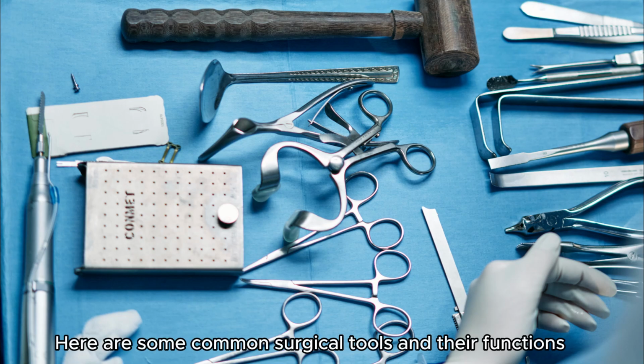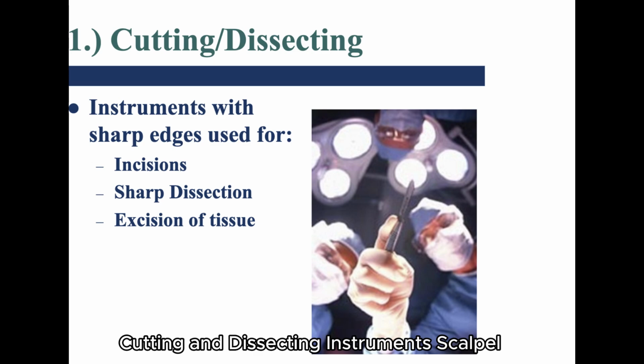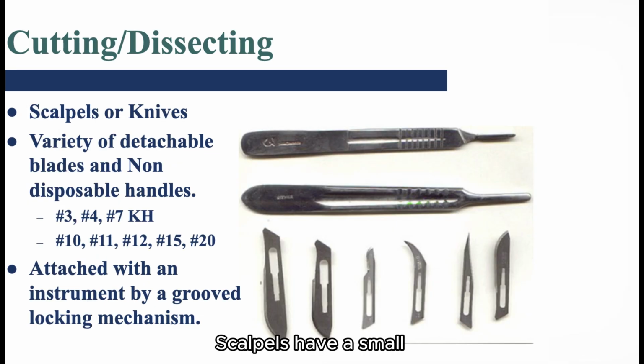Certainly. Here are some common surgical tools and their functions. Cutting and dissecting instruments. Scalpel, used for making incisions and cutting tissues. Scalpels have a small, sharp blade attached to a handle.